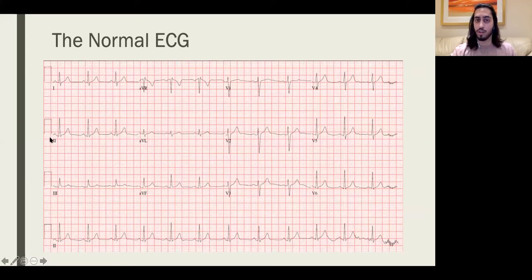So in your exams or in your OSCEs or whatever, if you actually point that out, people will be really impressed. So each of these little boxes are 1 millimeter. So this big box here, if it completes 10 of those little boxes, then the ECG is standardly calibrated.